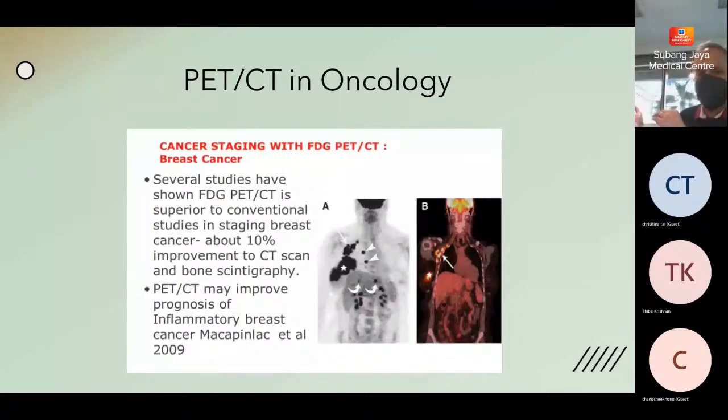But the cost of PET, but whenever we see on the CT component of the scan a sclerotic lesion that's not lighting up on the PET, we always recommend a bone scan to complement it so that you really truly know the true extent of disease.